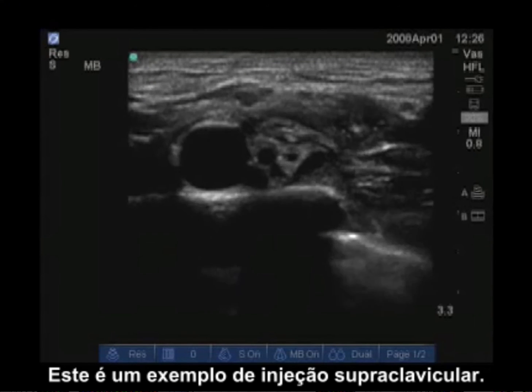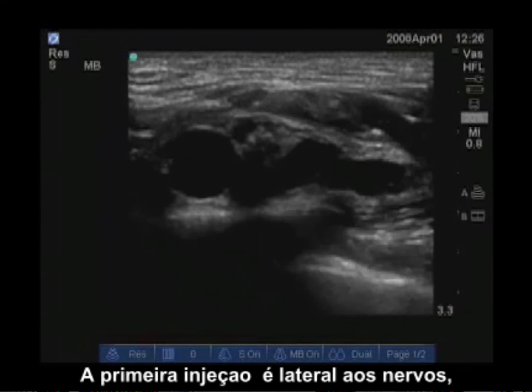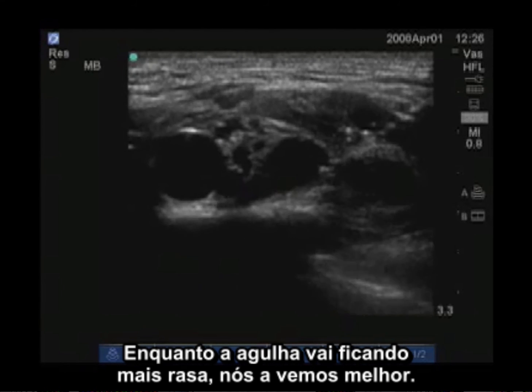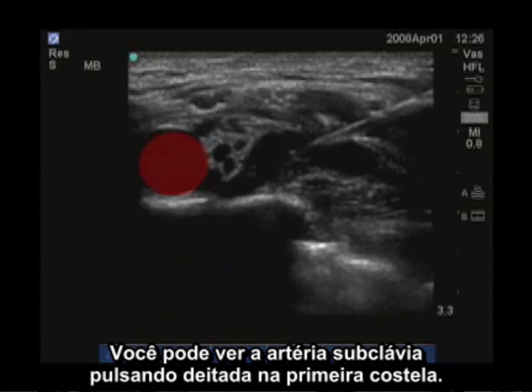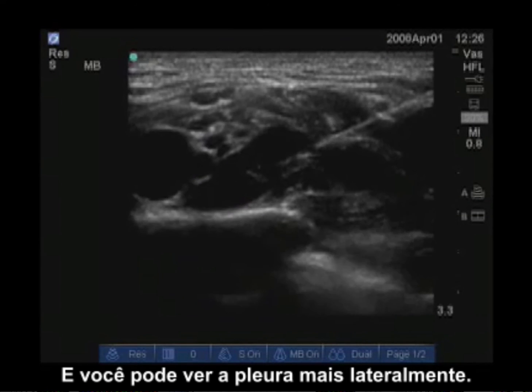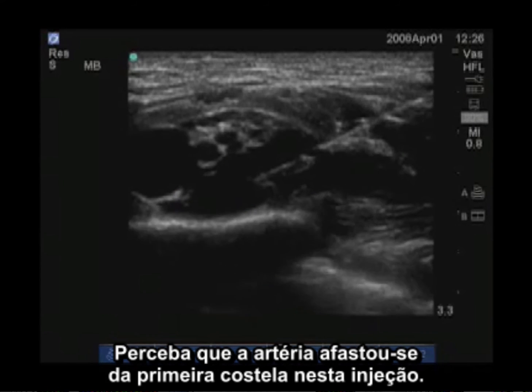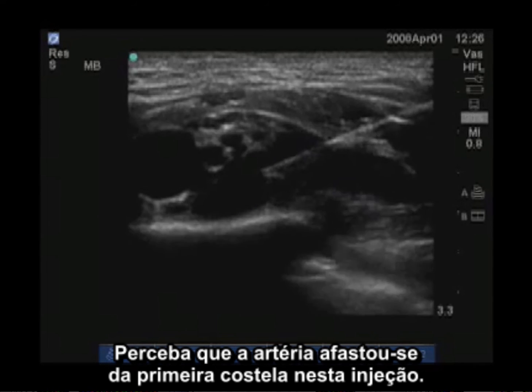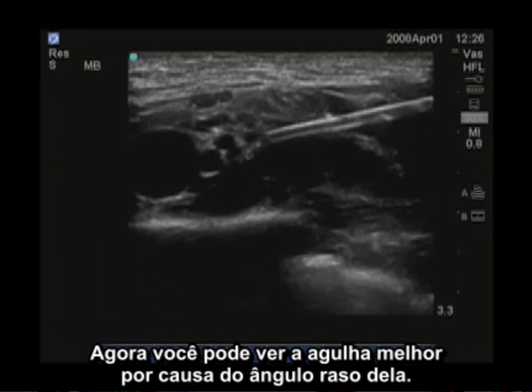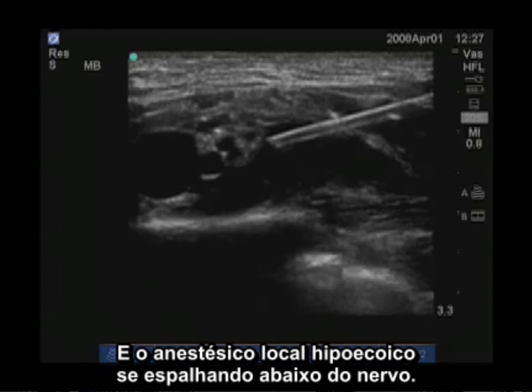This is an example of a supraclavicular injection. The first injection is lateral to the nerves. Our needle is barely visible because it is at a steep angle; as the needle is flattened out we will see it better. You can see the pulsating subclavian artery sitting on the first rib, and even the pleura more laterally. As the injection is put into the pocket between the artery and the first rib, notice the artery is even lifted off the first rib. Now you can see the needle much better because it is at a flat angle. You can see the nerves just posterior to the artery and the hypoechoic local anesthetic spreading below the nerves.